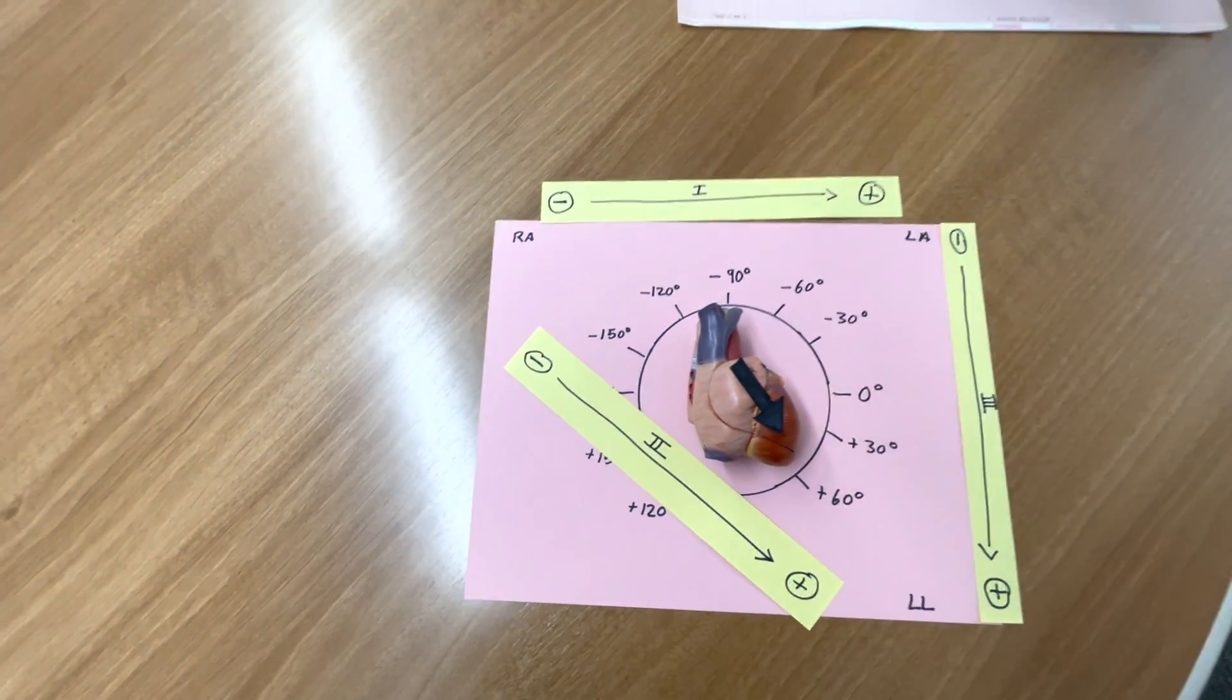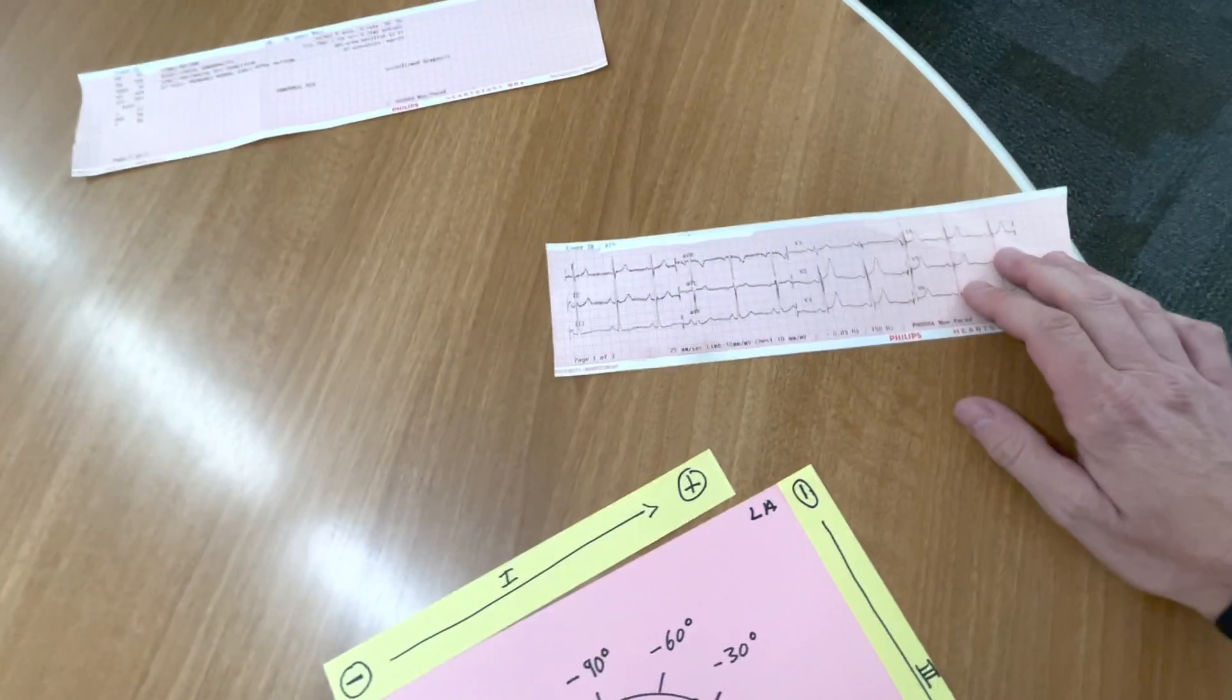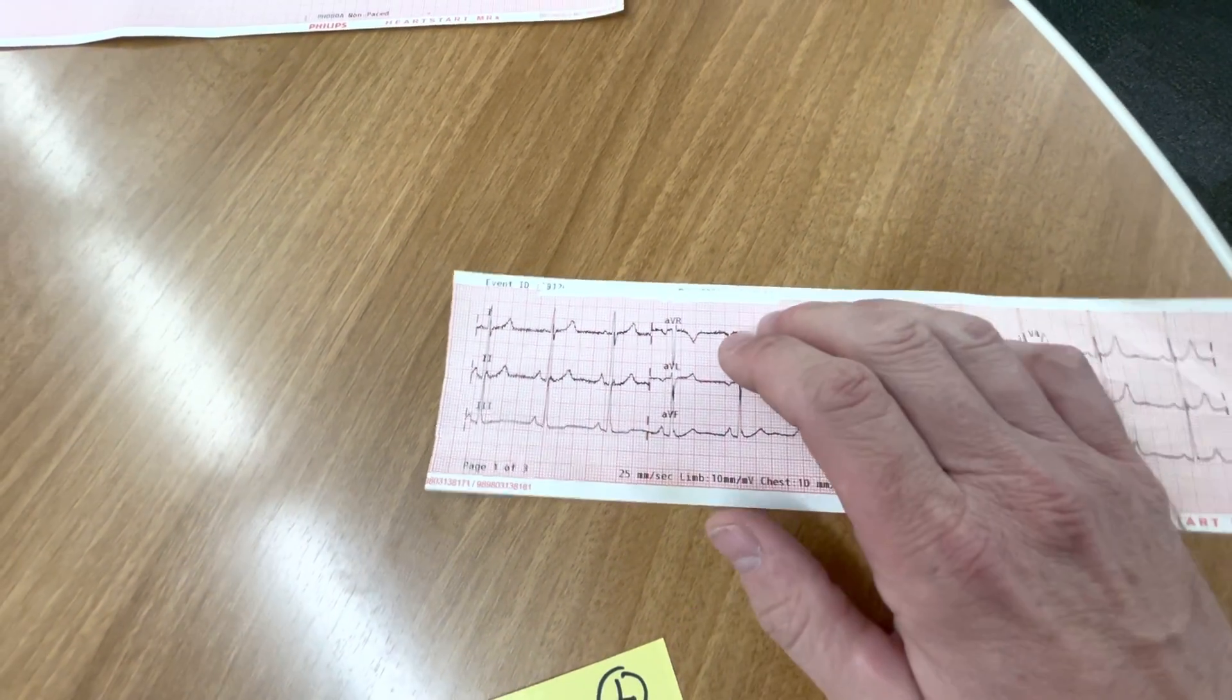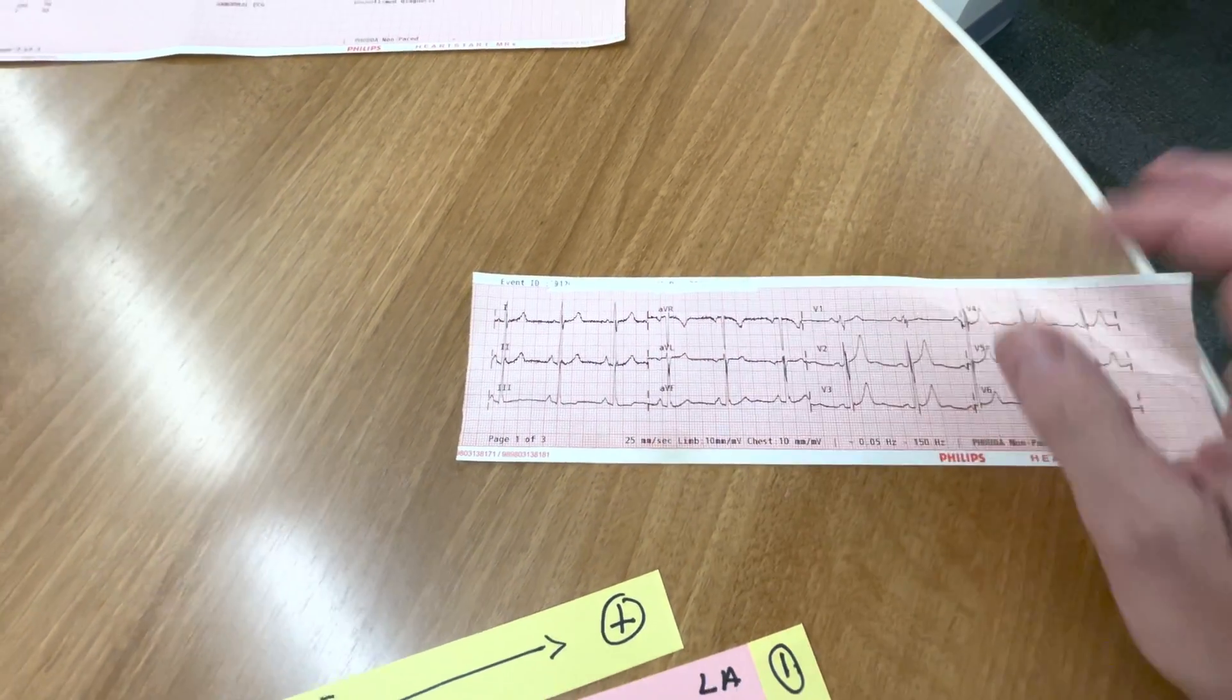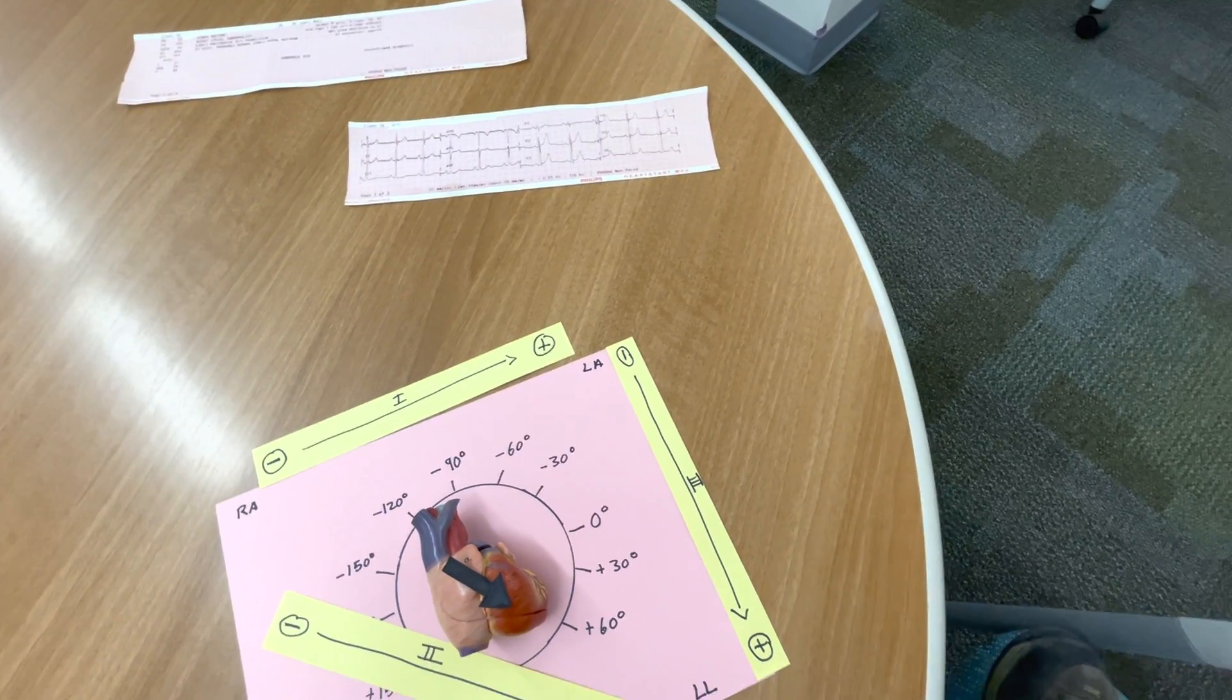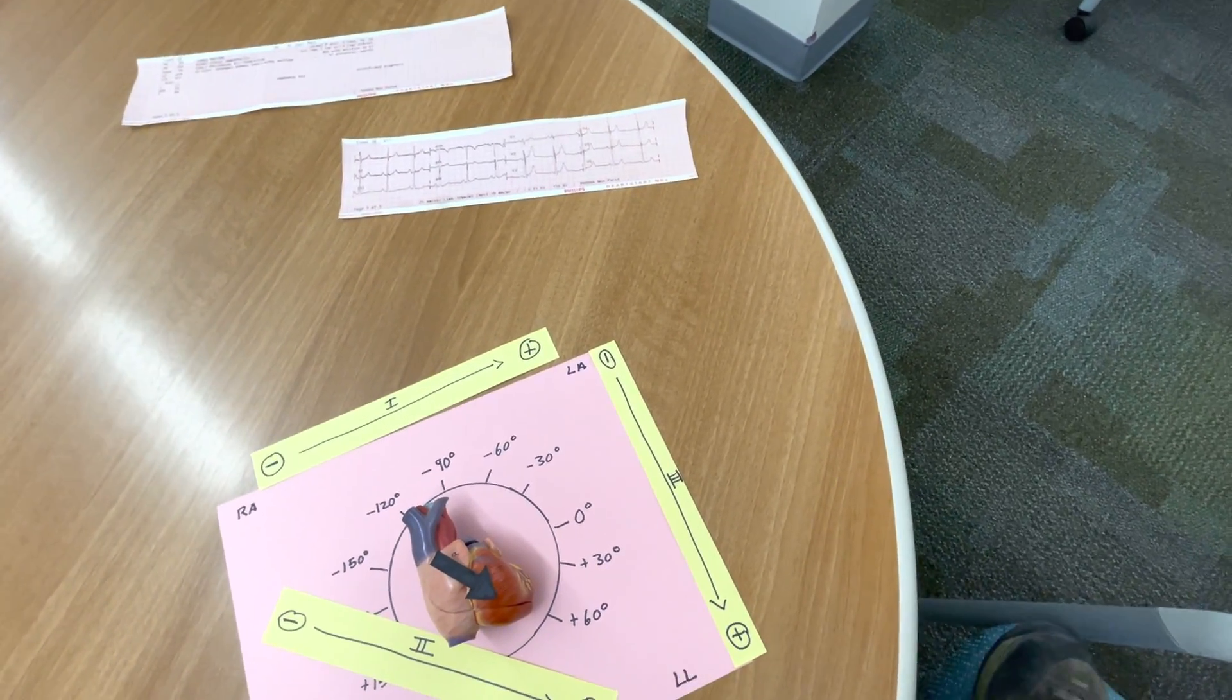And remember, whenever electrical activity is moving toward a positive electrode, that's going to produce positive deflection on the ECG. So, when I print a 12 lead off on somebody, and I look at the limb leads, 1, 2, and 3, and I see a QRS that is upright in all three leads, that tells me right away, without looking at numbers, that I'm dealing with someone that has normal axis.